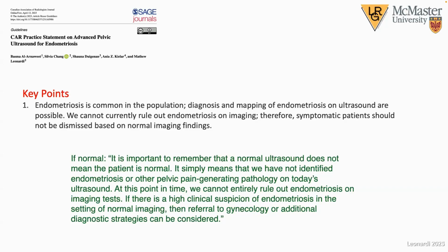It is important to remember that a normal ultrasound does not mean the patient is normal. It simply means we have not identified endometriosis or other pelvic pain generating pathology on today's ultrasound. At this time, we cannot rule out endometriosis on imaging tests. If there is a high clinical suspicion in the setting of normal imaging, referral on to gynecology or additional diagnostic strategies can be considered.